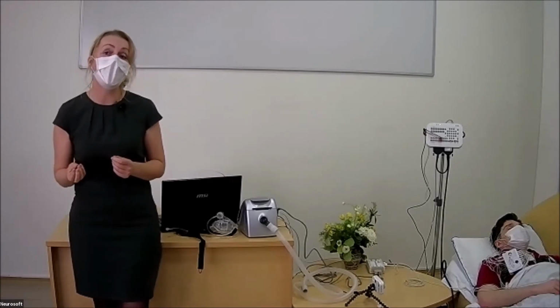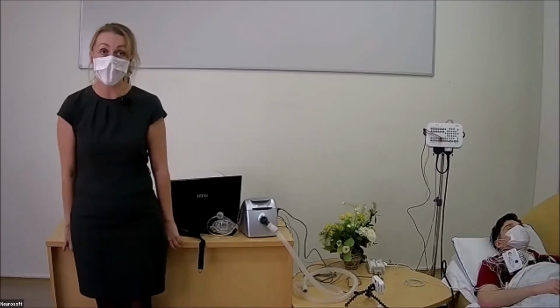On one hand, we need to have an effective pressure. On the other hand, we need to have a minimum value of effective pressure. Why? If the pressure is very high, our patient does not fall asleep. So it is very important to get the minimum effective pressure, the minimum value which prevents obstruction.